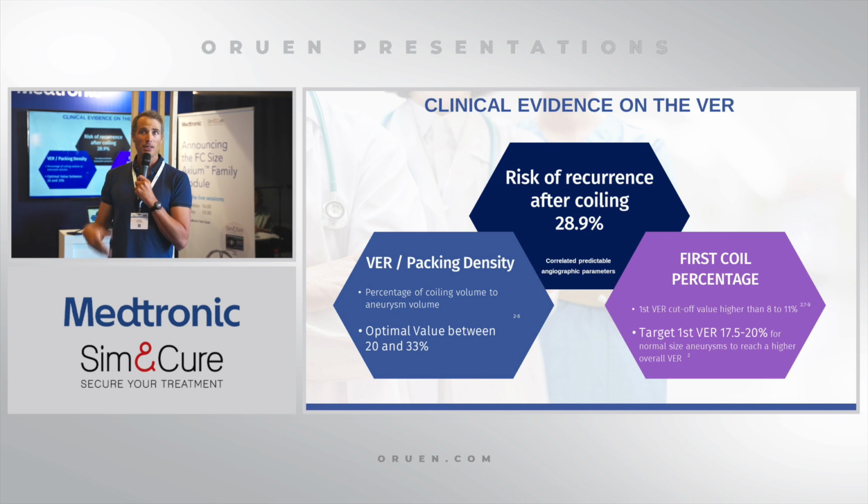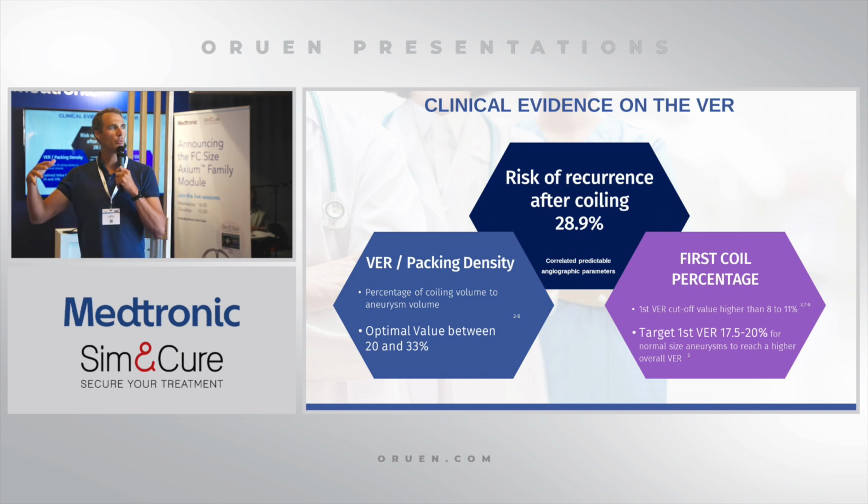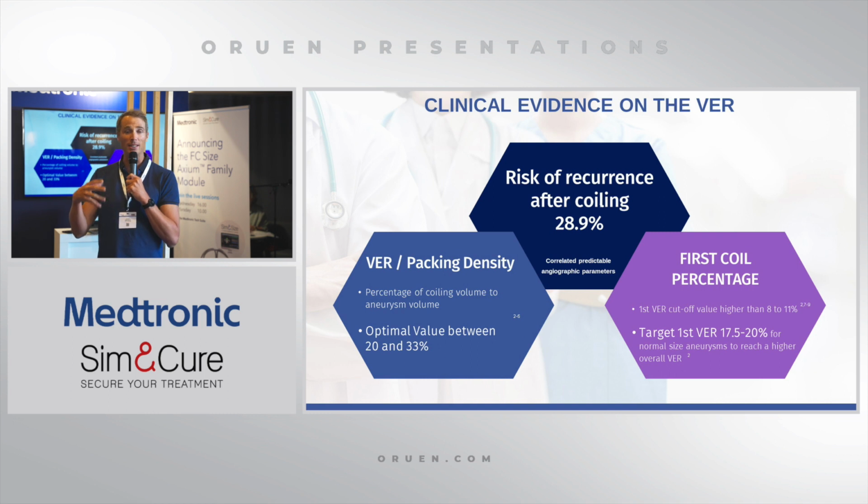If you do not achieve this goal, then you are facing more recanalization and then retreatment. So this is old literature, and over time we just forgot this goal of optimal volume embolization ratio because we did not have the tool to clearly measure the volume of the aneurysm and then understand this parameter of filling. It's impossible to take three manual measures in the angio suite, compute the volume, compute the volume of the coil, and then say, oh yes, after the first coil I'm at 10% filling of the aneurysm. It's hard to do, so it was a little bit forgotten by the community.